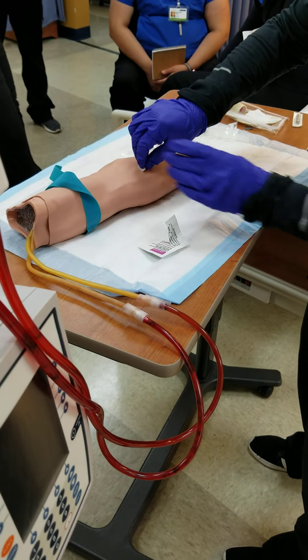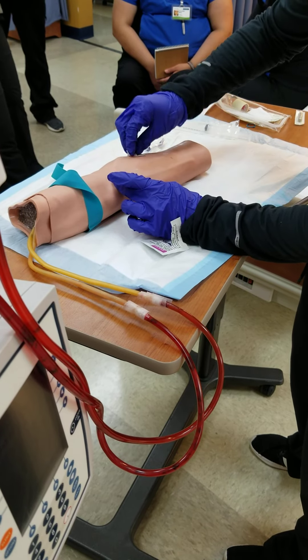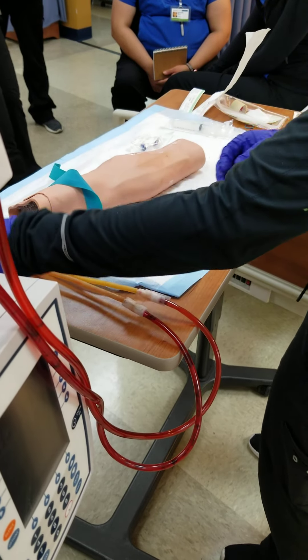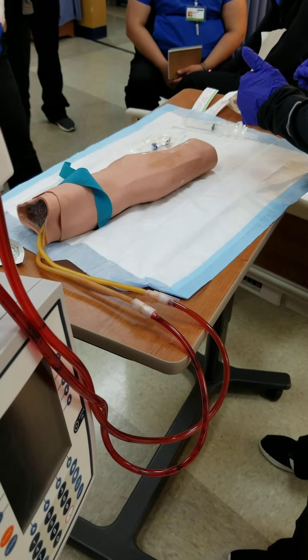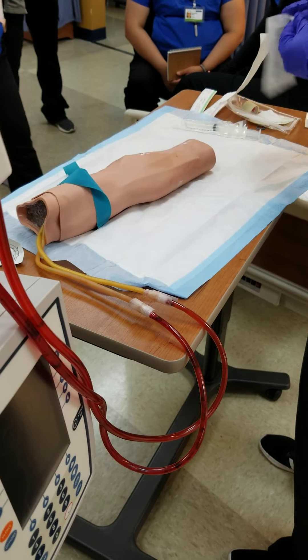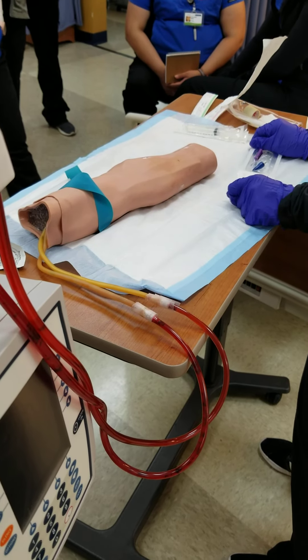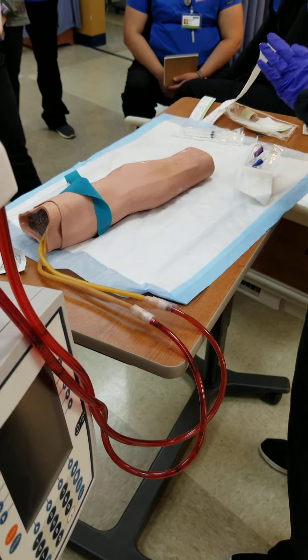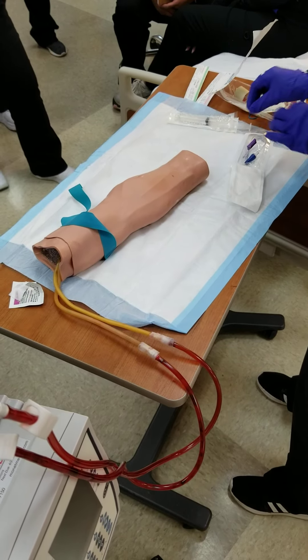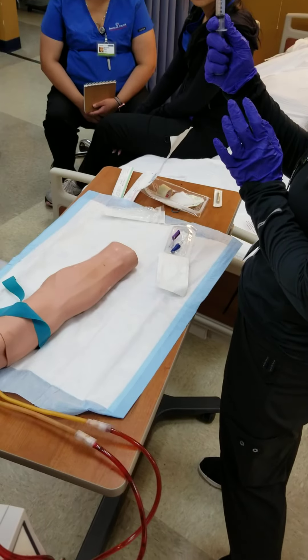How long do I clean? 30 seconds. So let's just say that it's been 30 seconds — 27, 28, 29, 30. Now I'm going to prepare the supplies while this is drying. Everyone does it differently. You may see it done differently and you may do it your own way — set everything up, then find the vein, then just go for it. However you want to do it is okay. You just have to make sure you do these certain things.